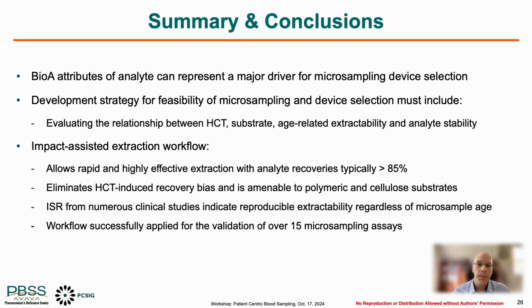And finally, impact-assisted extraction as a sample preparation workflow has demonstrated its universality by successfully supporting each and every application that it has been applied to in our laboratory, eliminating hematocrit bias and age-related extractability with recoveries typically in excess of 85%.